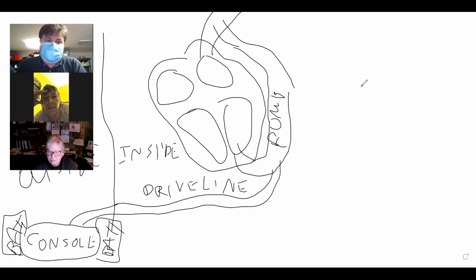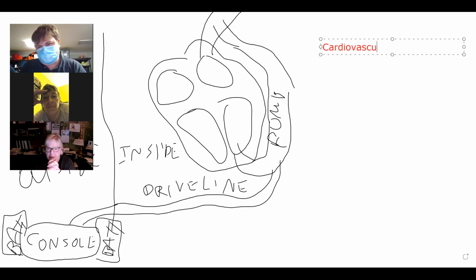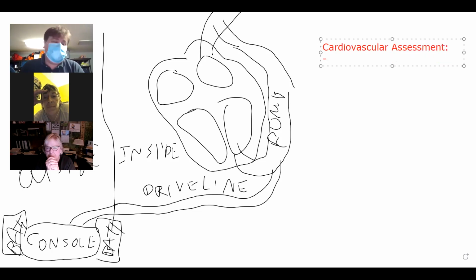If it is cardiovascular, however, in nature, you might have to do a couple of other things to troubleshoot. And in your cardiovascular assessment, you're going to find that a couple of things change. Okay, first of all, when we do our ABCs, you're going through airway, breathing, and circulation. What is the one vital thing that is essential to circulation that we assess on every patient? Pulse. Yes, absolutely. So we want to make sure that their heart is pumping.